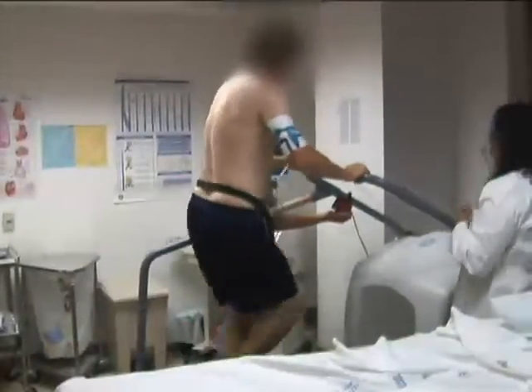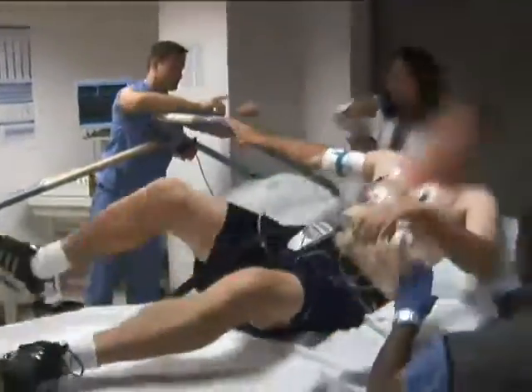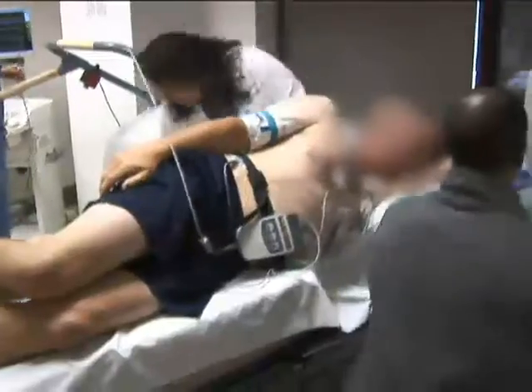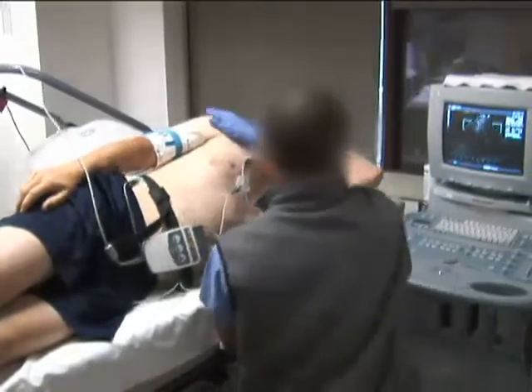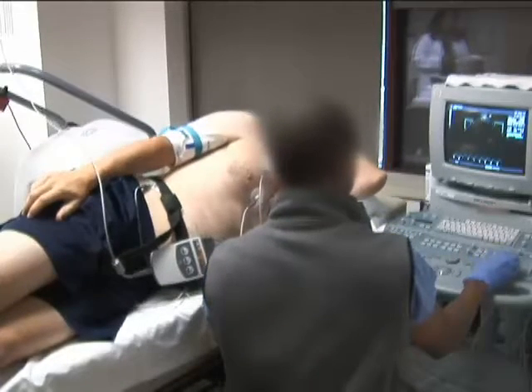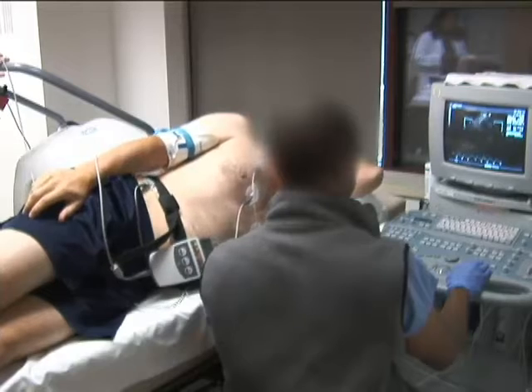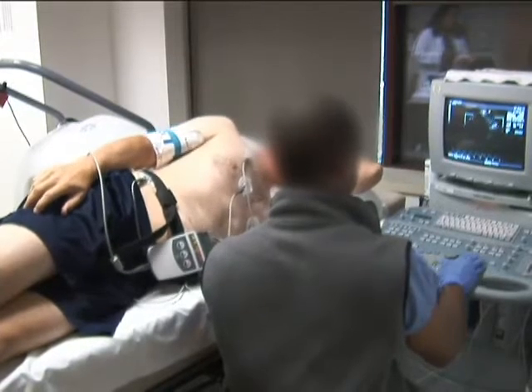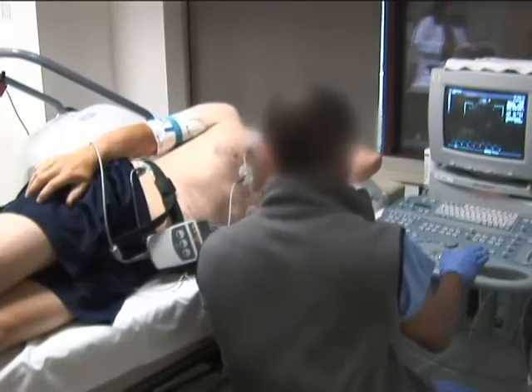Once the patient indicates that they need to discontinue exercise, the technician quickly stops the treadmill without a cool-down period. The patient rapidly transfers to the echo imaging bed, and immediate post-stress echo images are recorded from echo views concordant with the resting images. Immediate post-stress imaging should be completed within 60 to 90 seconds of cessation of treadmill exercise.